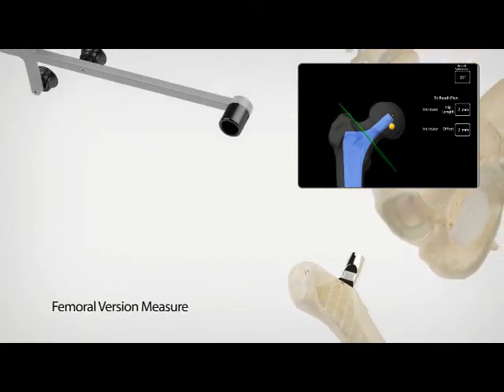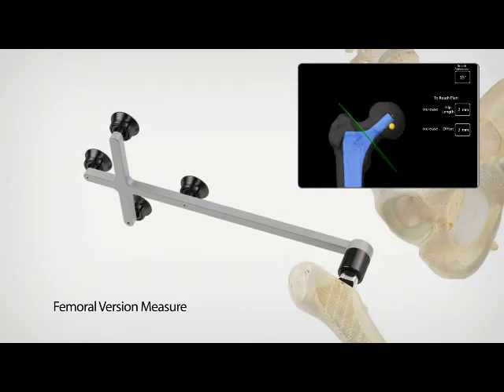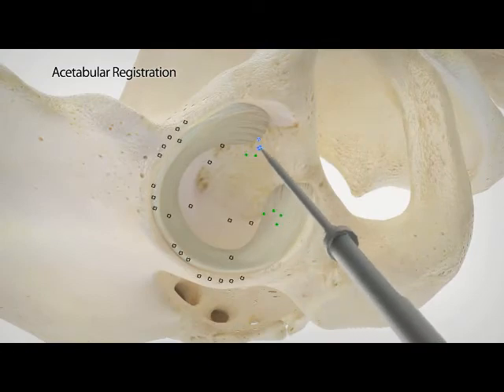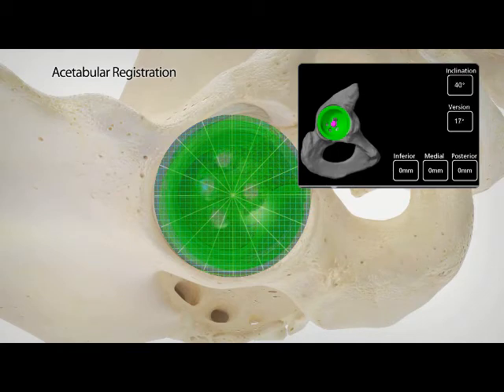The broach tracker is applied on the taper of the trial femoral stem and femoral version is measured. Utilizing the femoral version, the orientation of the acetabular cup can be intraoperatively adjusted to provide the optimal biomechanical reconstruction that is specific for each patient.